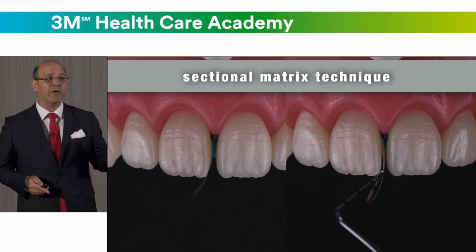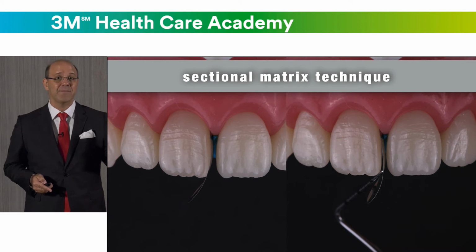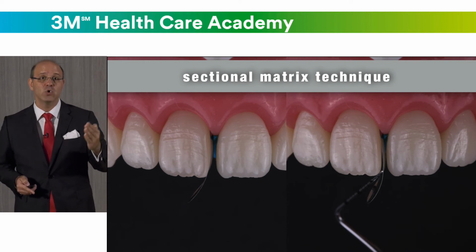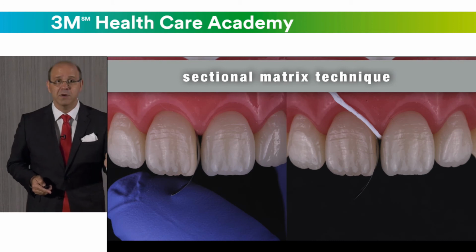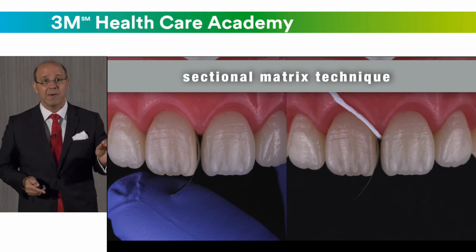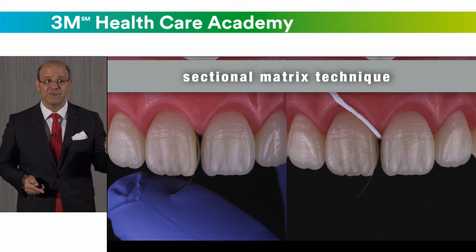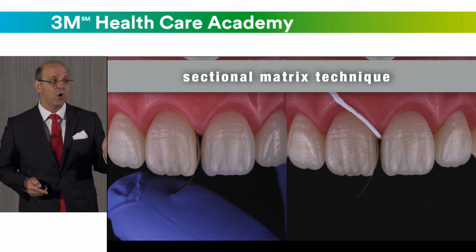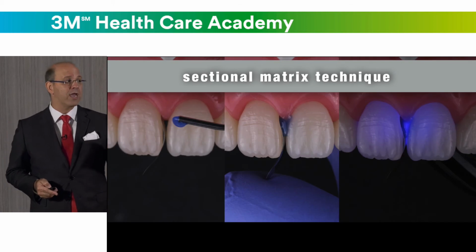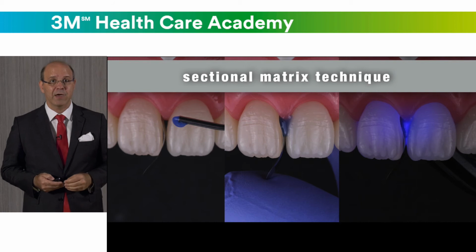And how can we fix the matrix in the cervical area so it can bend and we have a good contact point? We can use a wedge, a wood, a rubber, a plastic wedge, a thin one so as not to deform the shape of the matrix, or you can also use a Teflon roll on the cervical embrasure, or maybe you can use a blockout resin like from Polydentia, the My Custom Rings.